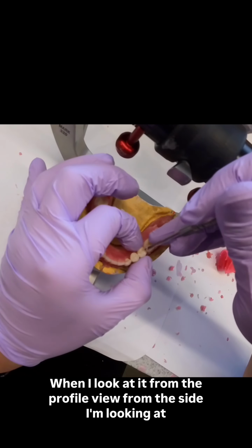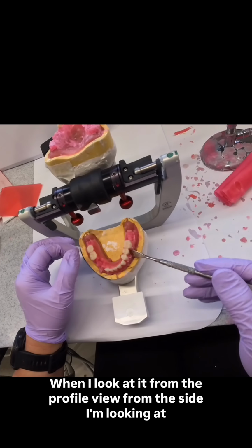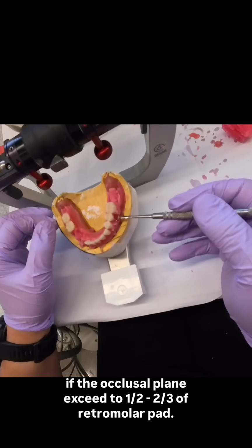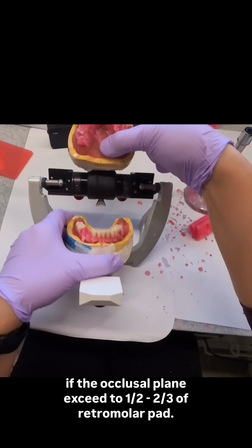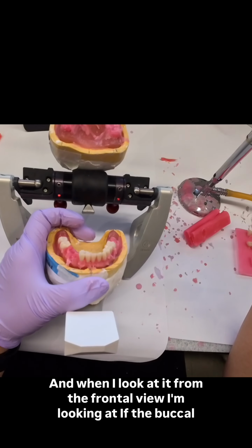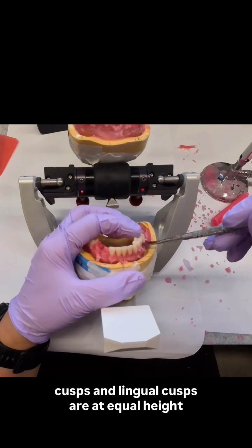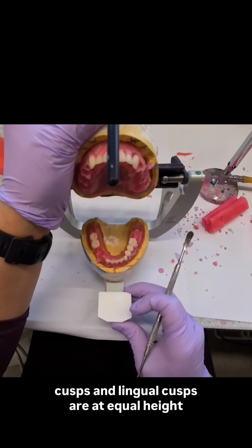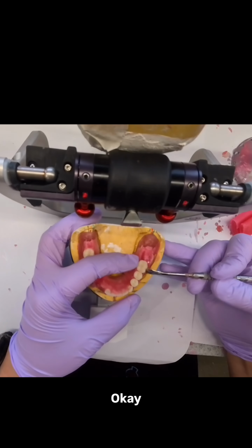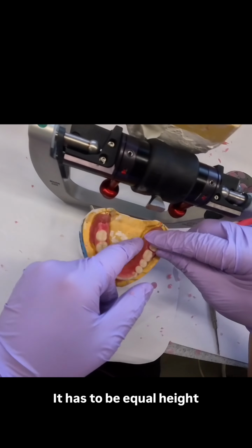Okay, when I look at it from the profile view from the side, I'm looking at if the occlusal plane exceeds half to 2/3 retromolar pad. And when I look at it from the frontal view, I'm looking at if the buccal cusp and lingual cusp are at equal height. Okay, it cannot have one taller than the other. It has to be equal height.